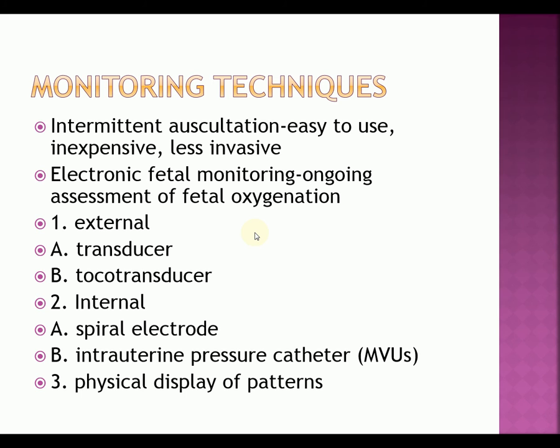Whereas with electronic fetal monitoring, the nurse can sit at the desk and monitor the patient for several hours before she goes back into the room, if she chooses to do so. It also lets you do 2 to 3 labors at one time until they get to the point where it's 1-to-1. So what about this electronic fetal monitoring?